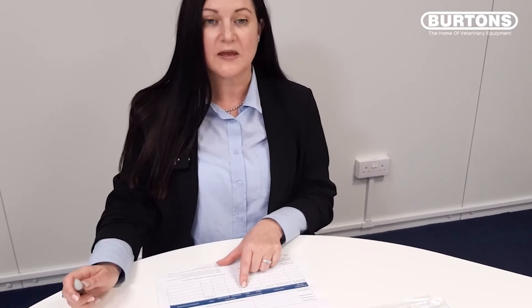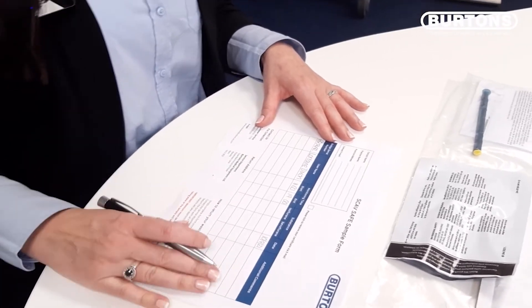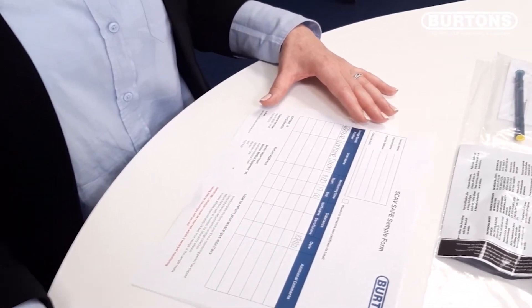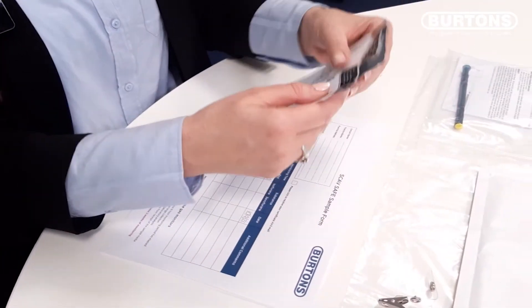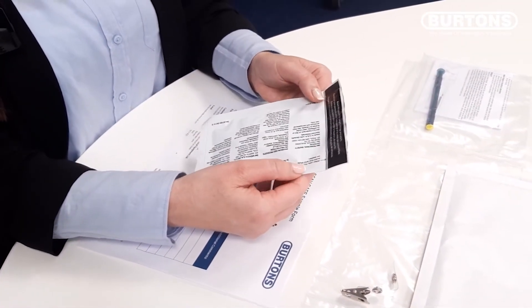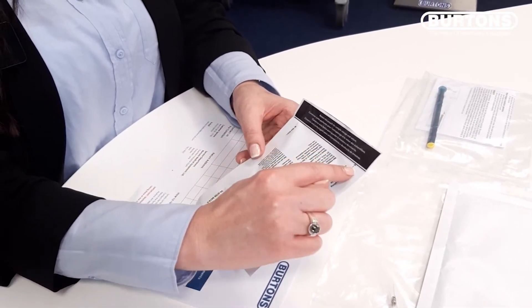Note the end time of the monitoring period on your sample form. Fold the pouch over along the solid line where indicated.